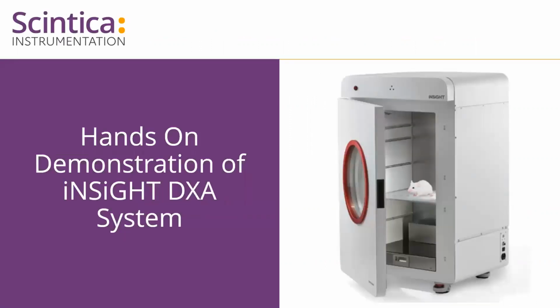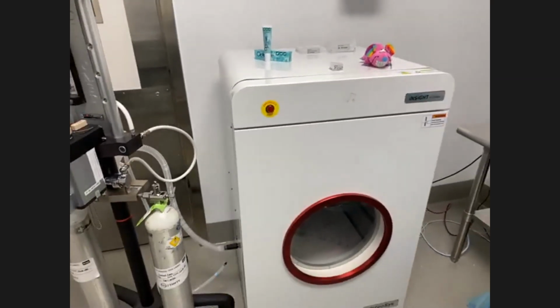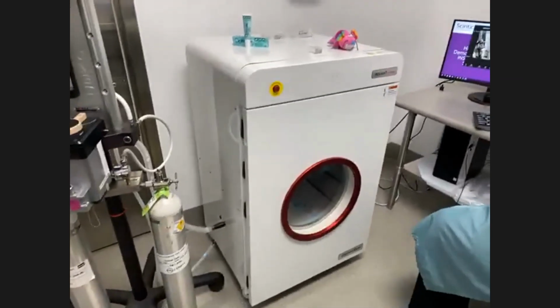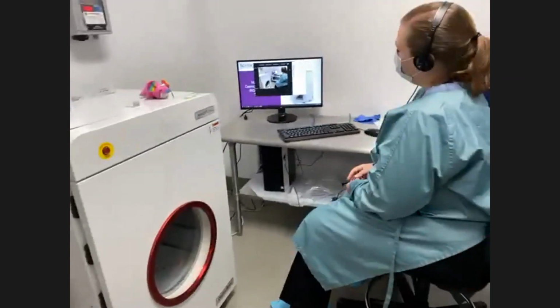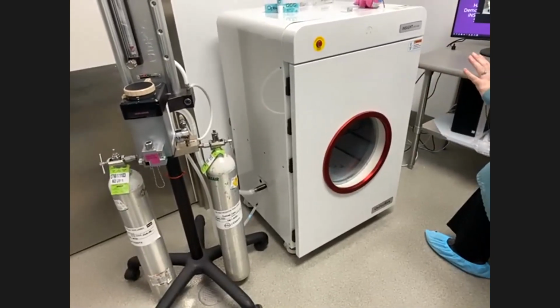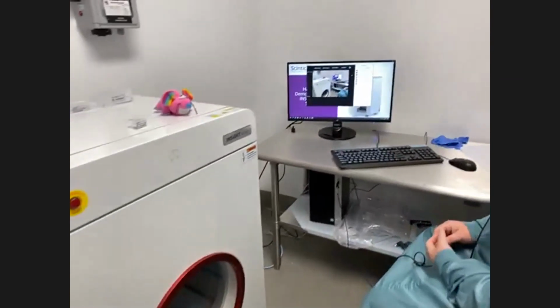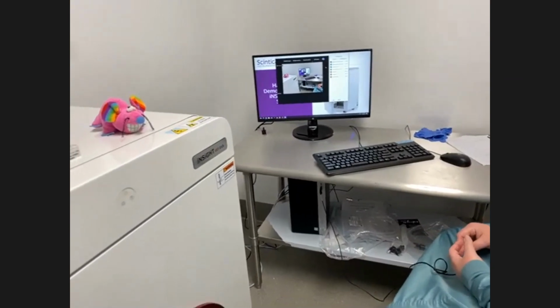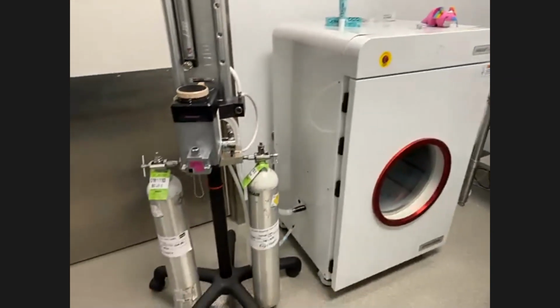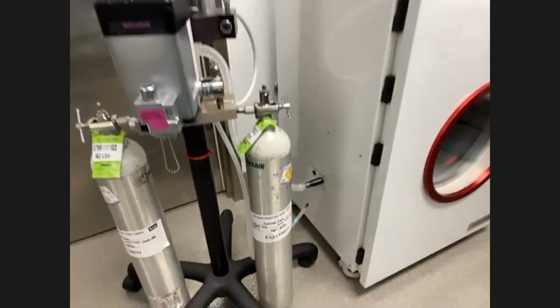So at this point, what I'm going to do is have my colleague Sonika turn on the camera so you can see the system in action. We've spotlighted that for you, so it should show up big on your screen at this point. So what you're seeing now is myself, and you can see the system as well. So the system is composed of the device that you see here, and then the computer and the workstation where the software will be displayed. There is the option for integrating anesthesia, and so this group has a mobile stand off to the side. You could have a stationary system set on top of the instrument as well. It's completely up to you.